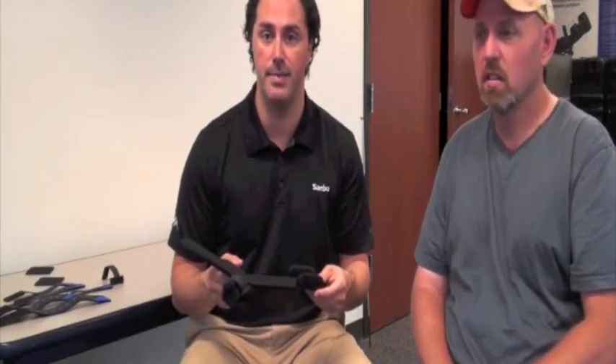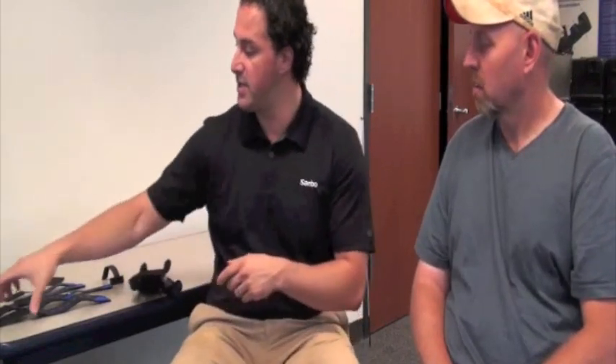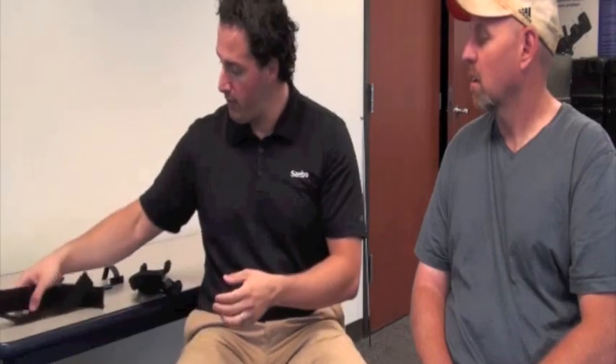At this stage, we're ready to put the device on and apply the straps. There are two forearm straps: a proximal forearm strap and a distal forearm strap. The proximal forearm strap is longer and is applied proximal on the forearm. The distal forearm strap is applied near the wrist. The first thing we want to do when putting the device on Tony is apply the forearm straps.